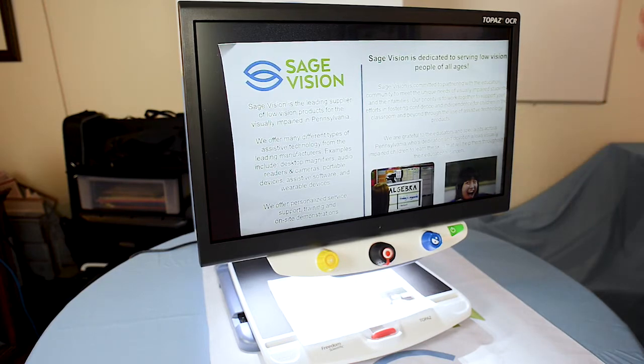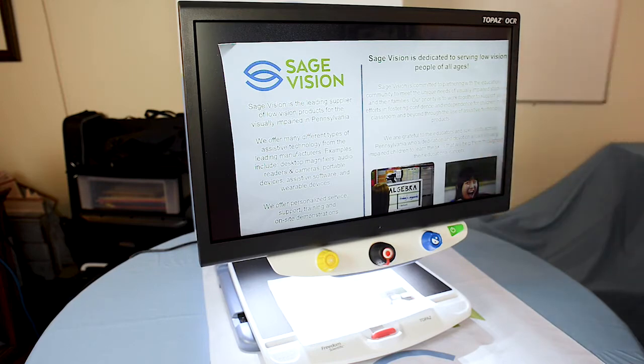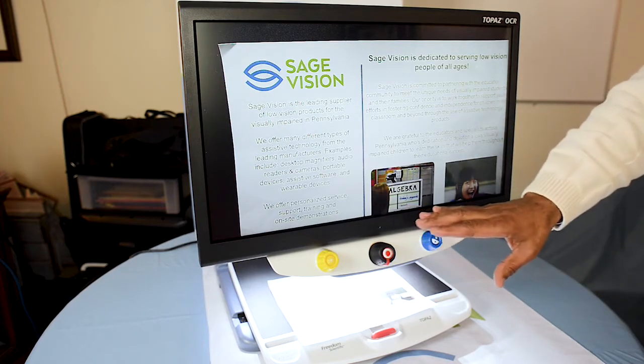This 24-inch screen is touchscreen. I'm also going to show you the magnification, contrast, and brightness controls.